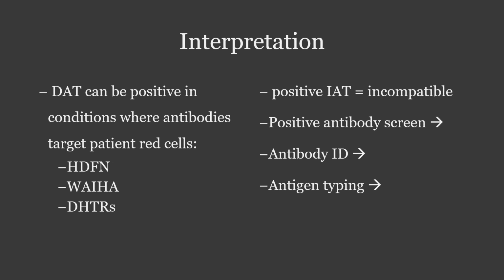And then once we've found some antigen-negative donor units, we have to cross-match them, which is another IAT, where we test the antigen-negative donor units against the recipient plasma just to make sure there's no funny business that we missed in the previous testing. Agglutination at the cross-match stage means the units are incompatible with the recipient. No agglutination means no potentially hemolyzing antibodies were detected.